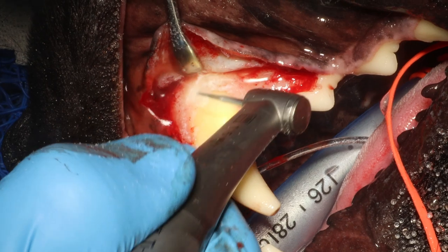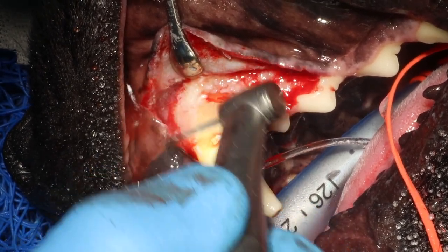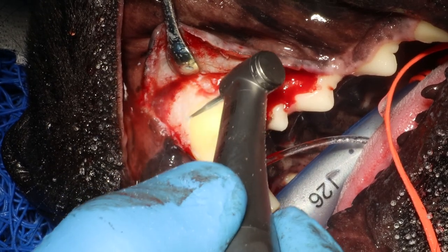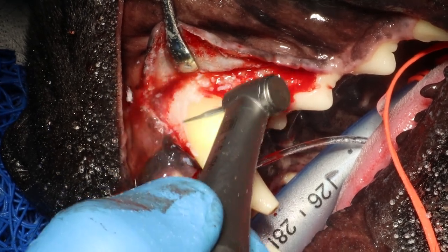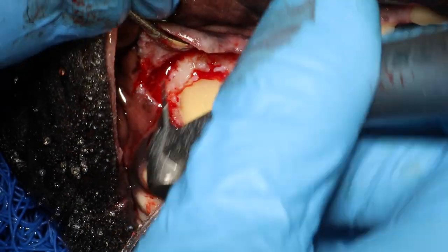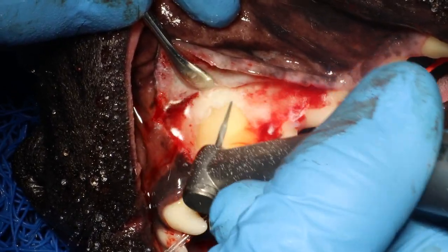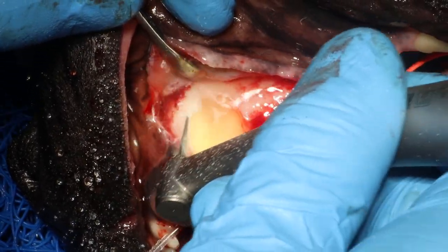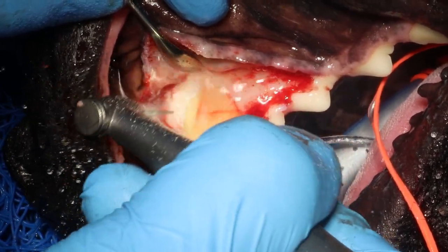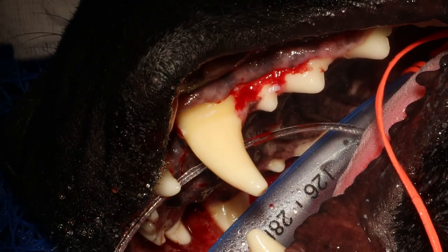You can remove bone all the way up to the apex if you really need to — just make your flap bigger and you can remove a lot more. Now I'm just using sweeping motions to outline the root, continuing to remove buccal bone to expose more of the root. I like to keep it very clean so I can see exactly what is what.